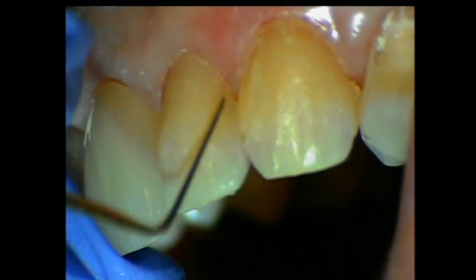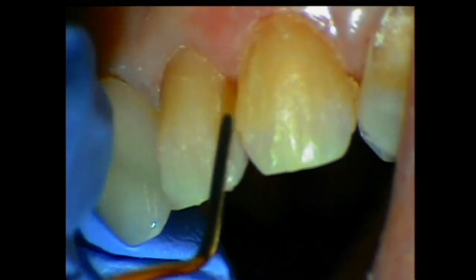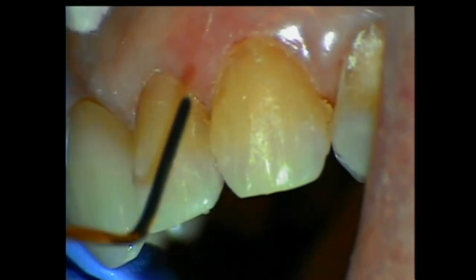There's nothing that handles like this material. There's no material on the market that handles like this, and no material on the market polishes and finishes like this.